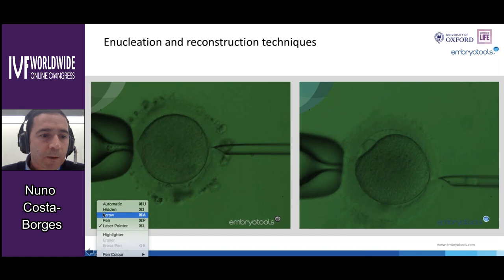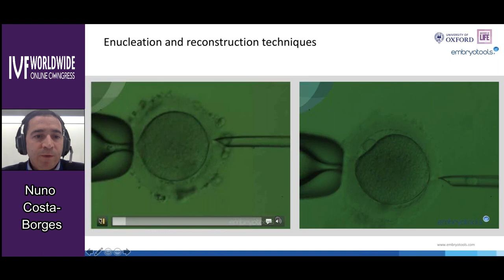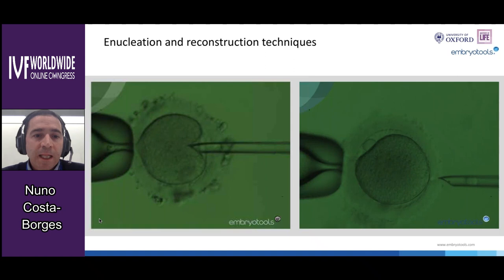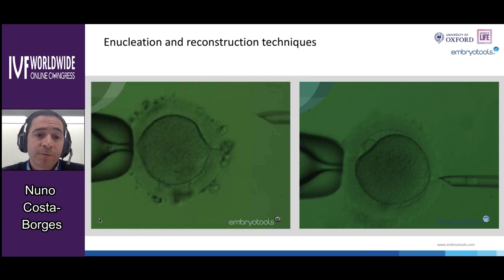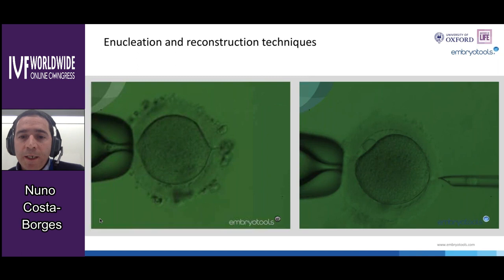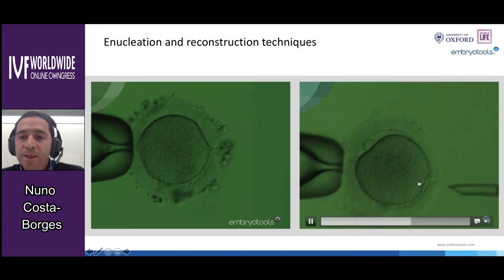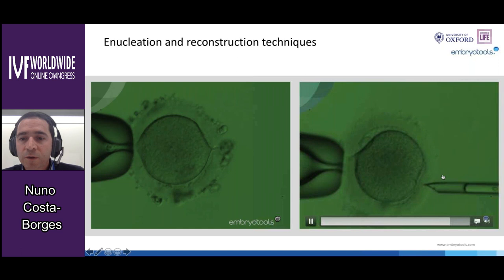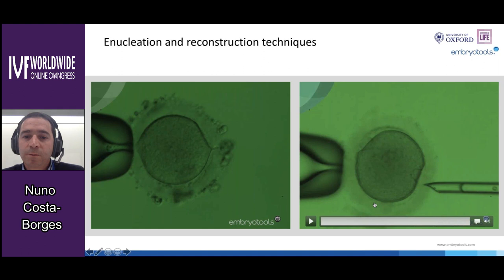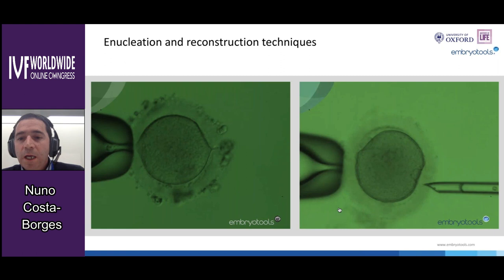Here is a video showing how the enucleation is performed. This is done in an inverted microscope with polarized light that allows us to see the birefringence of the meiotic spindle. And here is another video of the reconstruction process. This is performed with the help of a laser that allows a small cut in the zona pellucida, through which we introduce the karyoplast containing the meiotic spindle into the perivitelline space of the enucleated donor oocyte. After a few minutes, the karyoplast is fused to the cytoplast.